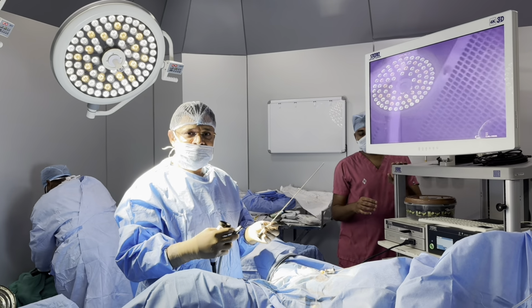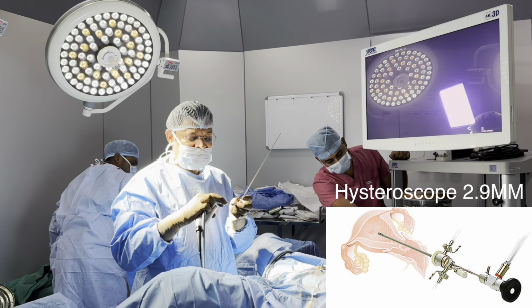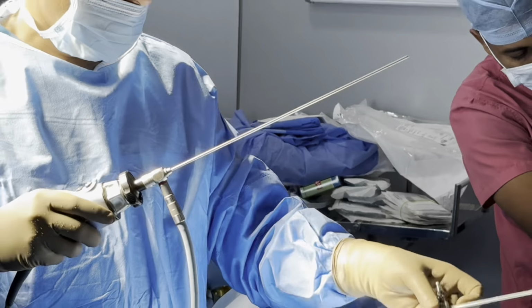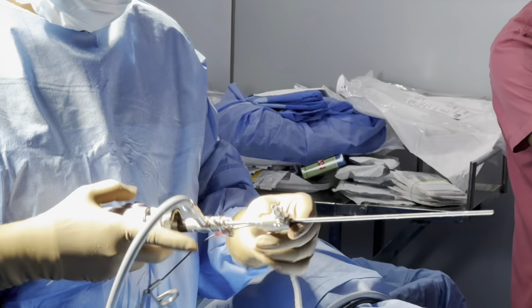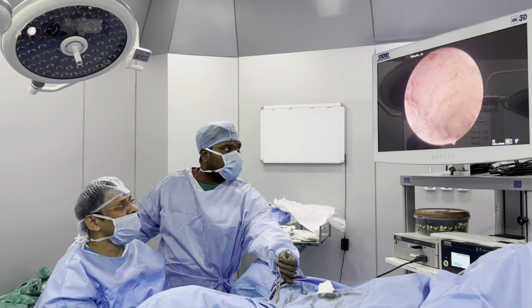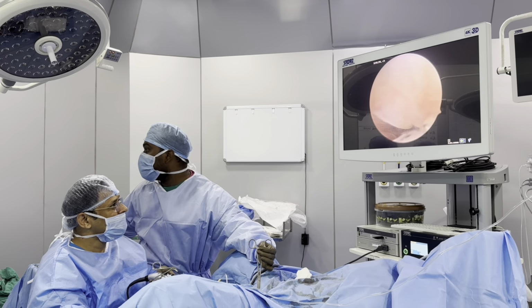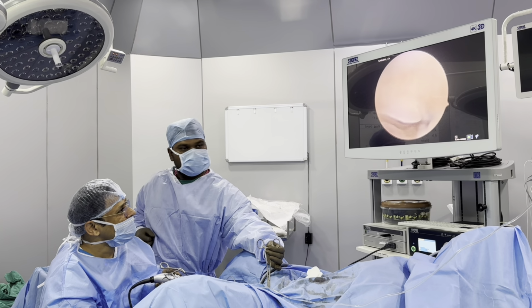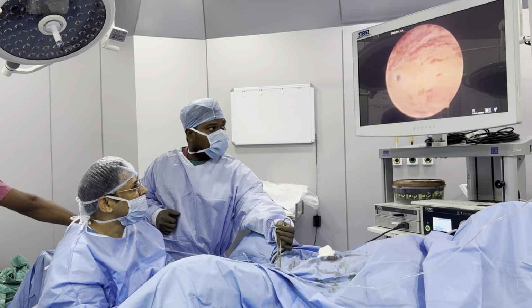So we are going to start with the hysteroscopy. This is a 2.9 mm, very small, tiny hysteroscope, which we are going to use for this patient. So we are entering into the cervix. This is the endocervical canal. This is the internal os. From here the uterine cavity proper starts, and we are entering inside the cavity of the uterus, and we are now inspecting the cavity.